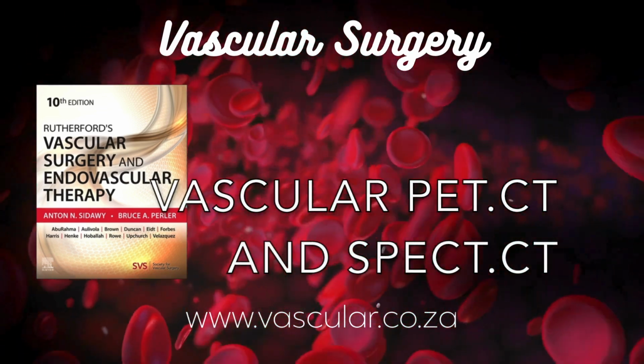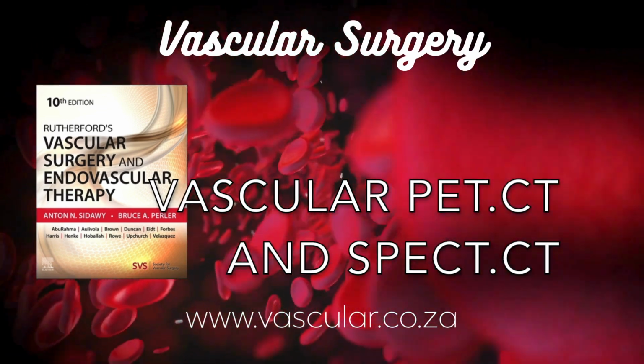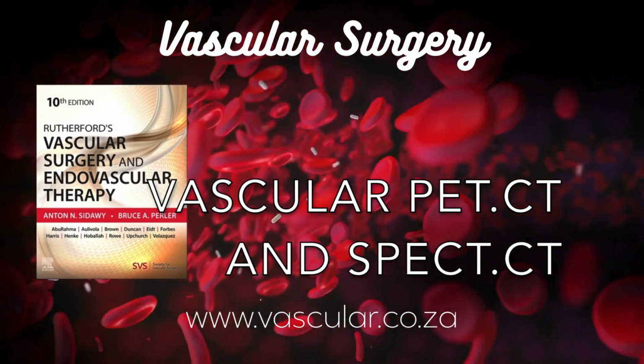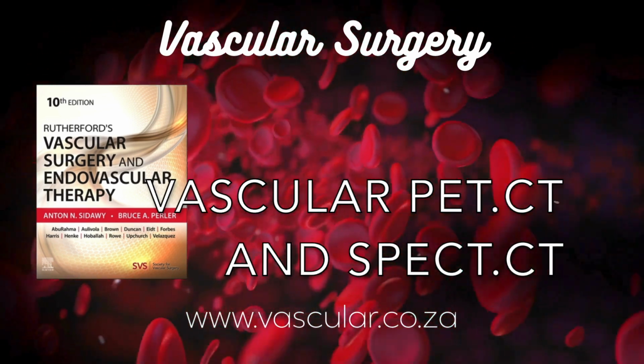And its role in vascular? It's used particularly for suspected vascular graft infections, which we can talk more about later, but the complexity and time involved are limitations. Okay. FDG, NaF, labeled white cells. Are there others being explored?